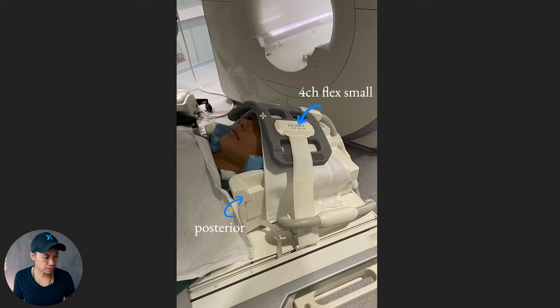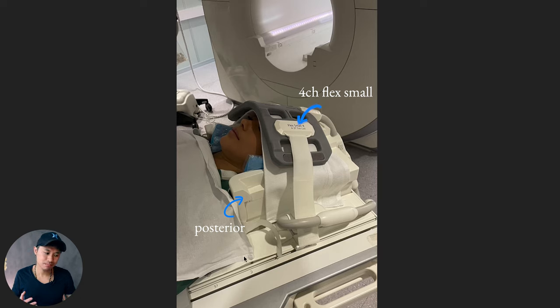Let me show you how I positioned the coil. I wrap the four-channel flex coil right there, strapping it on both sides. Remember to watch out for the cable so it won't get stuck. This is how we did it.